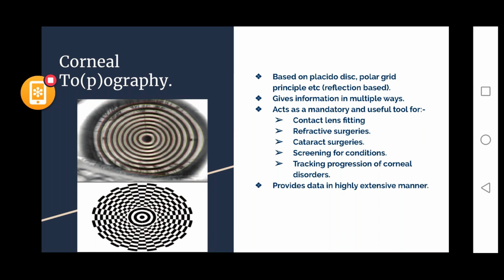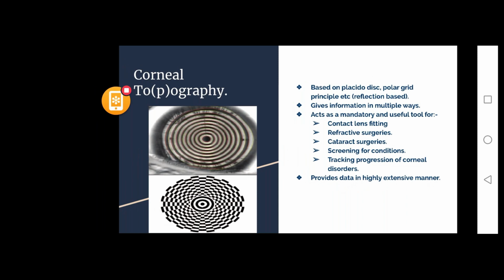which we missed out. That is that, suppose a patient has undergone any kind of LASIK surgery, hyperopic or myopic. That kind of surgery can affect your IOL calculation. Now there could be some patients who may not give a history of refractive surgery, but they have undergone refractive surgeries. So how do we find that out? Topography could be a very good tool in finding that out, right?